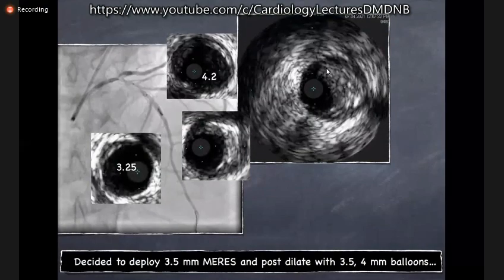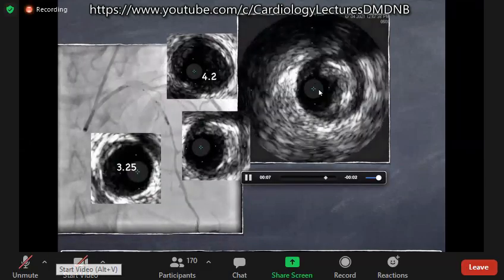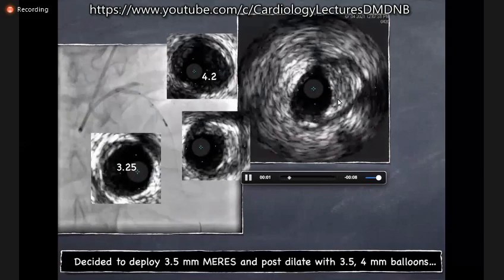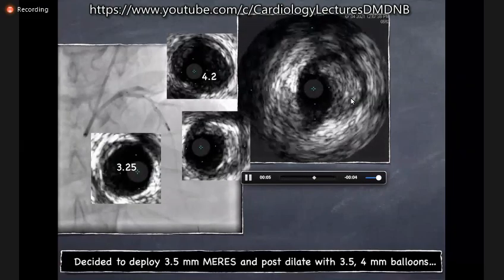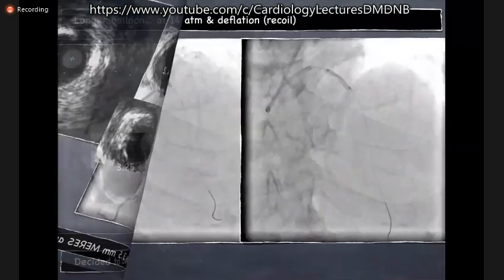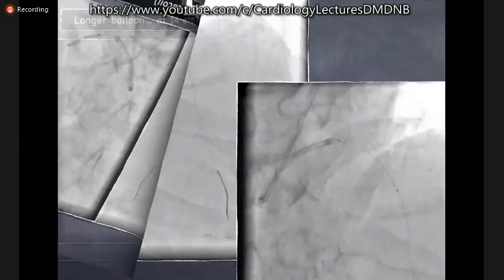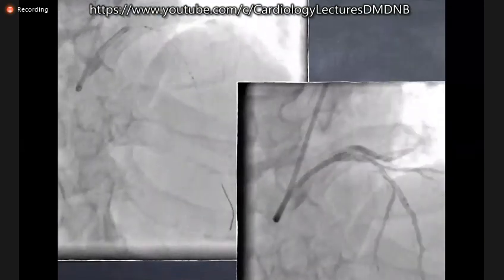Even though angiographically it was not looking critical, you could see that the plaque burden is so huge. There is calcification there, a 90 degree arc of calcification. It is more of a fibrotic plaque, and the minimal luminal area was just 3.1 millimeter. We dilated it with a 3.5 millimeter balloon, and tracking the scaffold was not difficult.